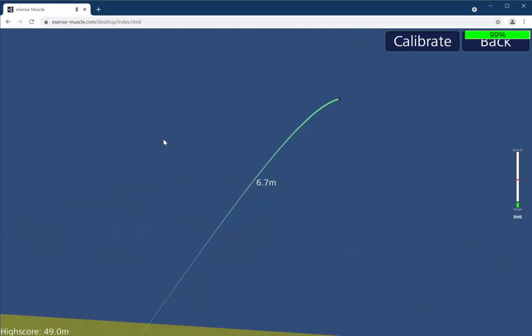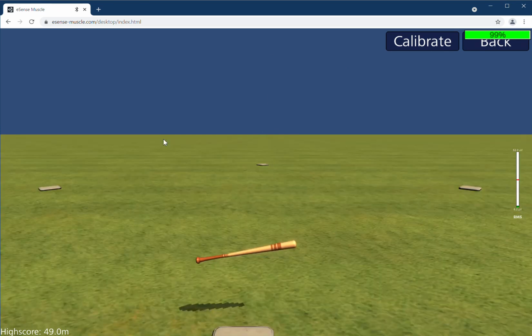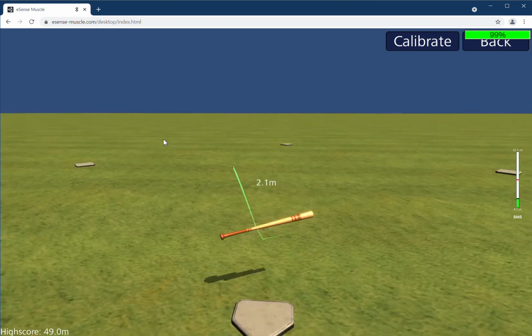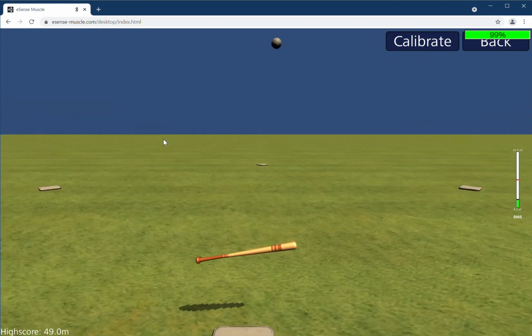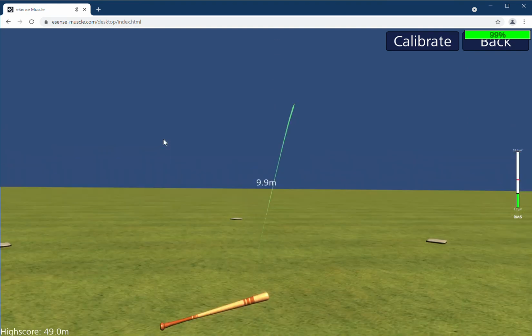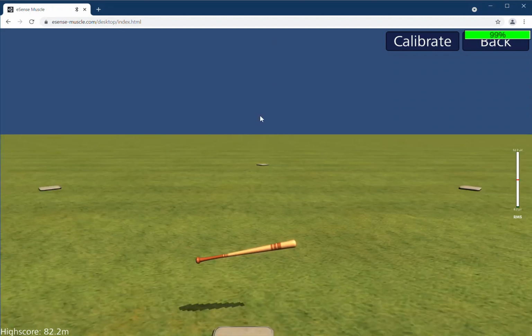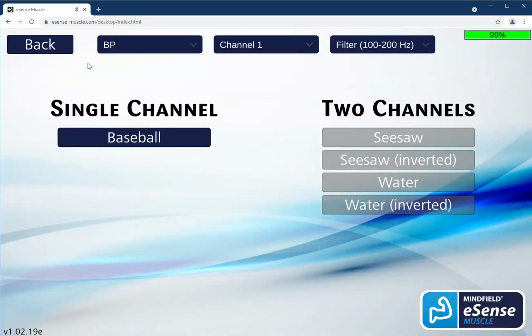And then you see you get some distance, and in the lower left corner you have the high score. I'll try to show you a good hit. No, too late, too late, too early, too early, too early again. Okay. 82 meters. That's okay for this demo. So here you can try to get the best high scores. And if you want to train this with another channel or another filter, you can just change it here.